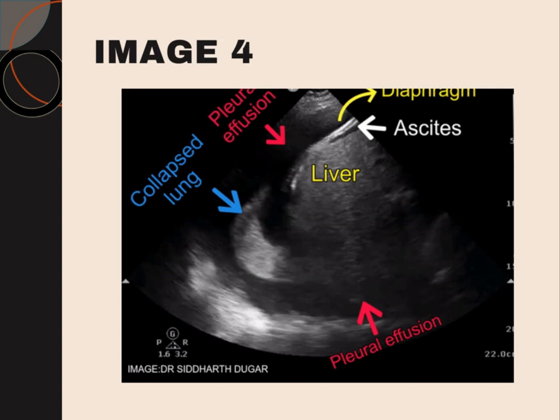So this gives an idea, if you are ultrasound trained, of where to intervene. Otherwise, back home we were just going to intervene with the percussion method. But here we need to be ultrasound trained before any sort of pleural effusion intervention. If you're not trained and confident to perform the procedure, ask someone to point it out for you, mark the point of insertion, and then intervene.